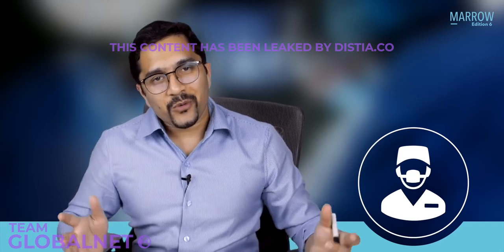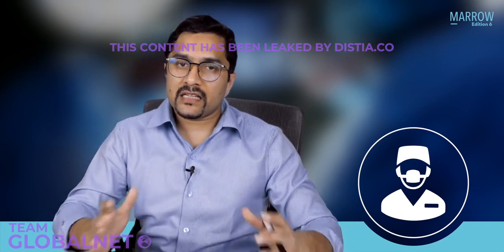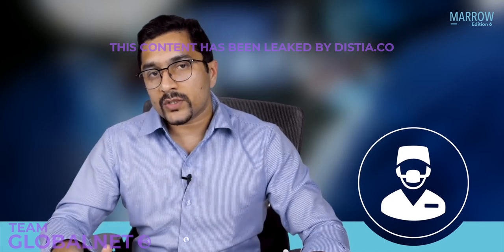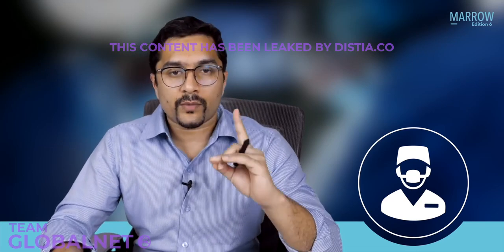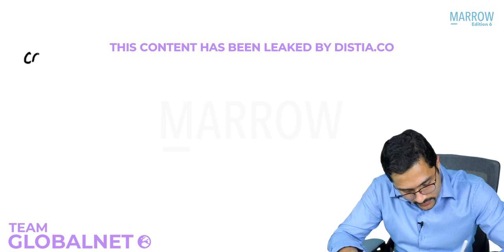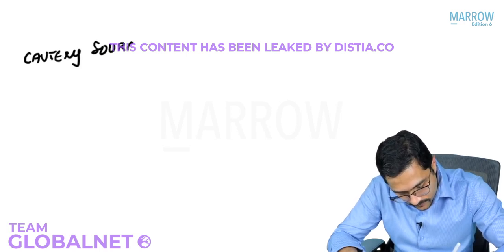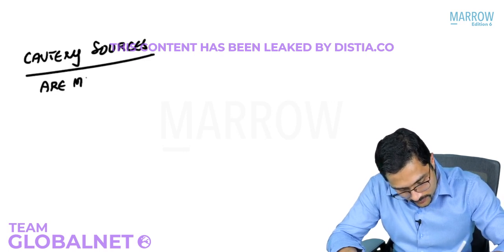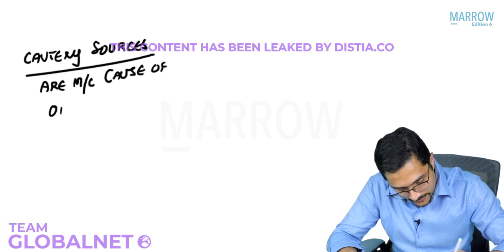But these are not the only energy sources. In fact, a lot of development has been made in the field of energy sources, and lots of energy sources are available which we'll discuss. But before I do that, one very important question which has been asked multiple times in the exam: cautery sources are the most common cause of OT related fires.